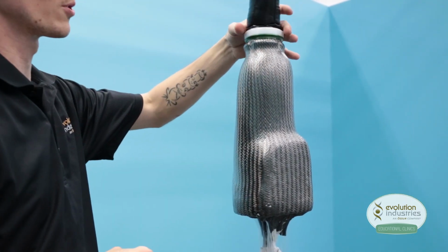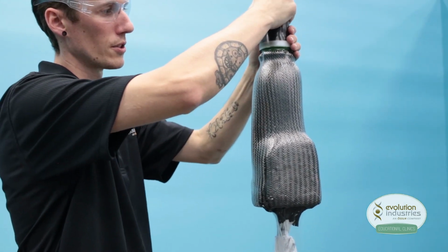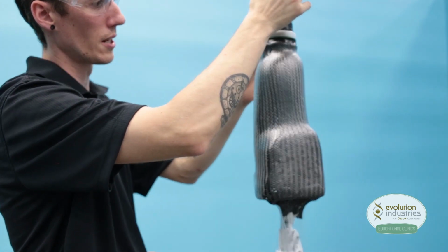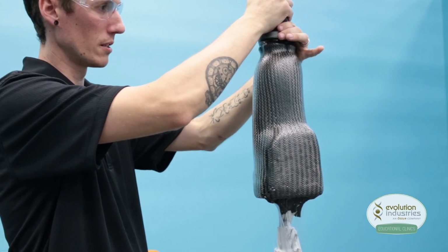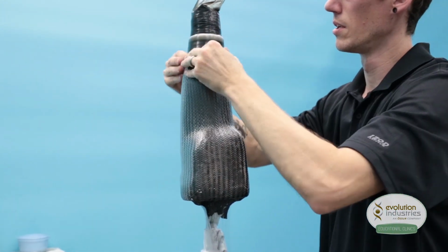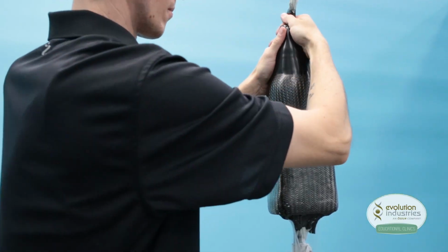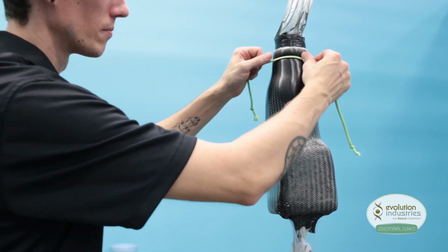Now, as you can see, we still have our seal around the lamination dummy. So if you just squeeze a little bit down through, and just let it slowly soak in at a time, and that'll help avoid getting any air trapped below the plate. You can also massage any air bubbles that you may suspect be there. And then you can start drawing it down with a string.